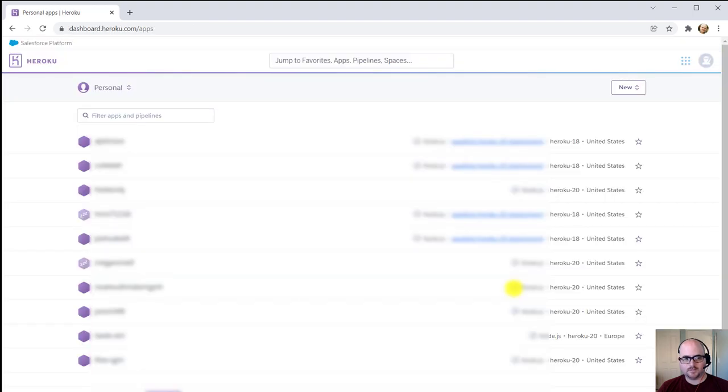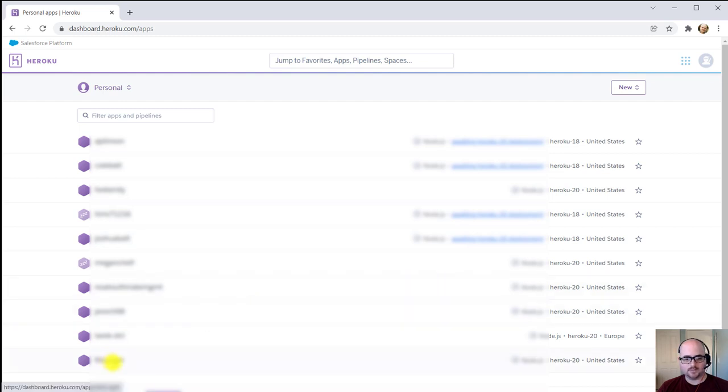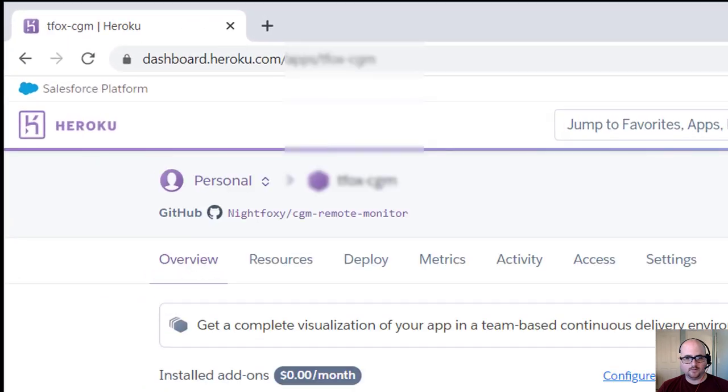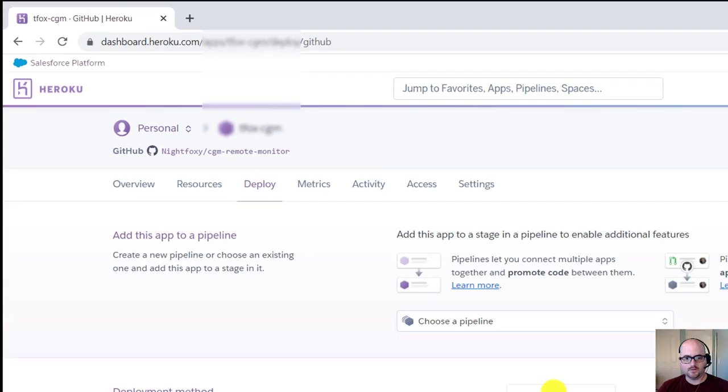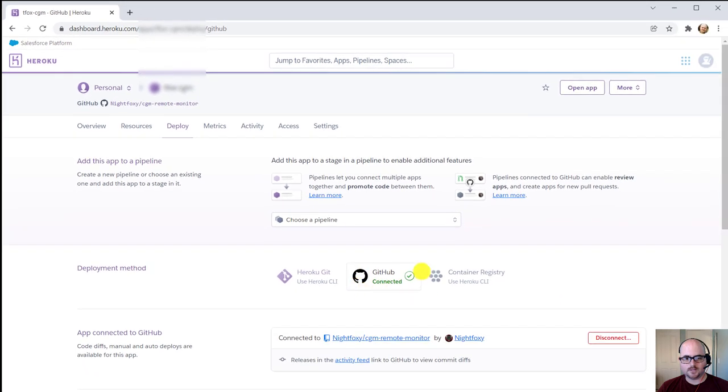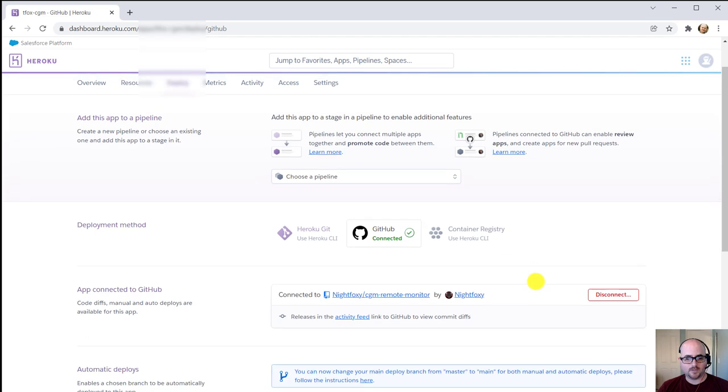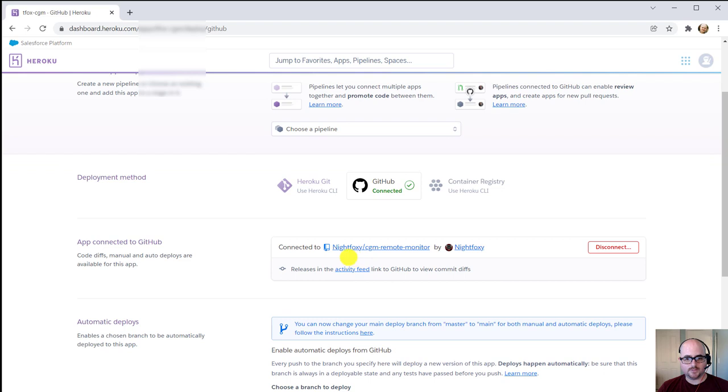From here you'll see your list of sites. Find one you want to update and click on the name of the site. From here you'll go to the Deploy tab here in the center. You should see that GitHub is successfully connected to your Heroku account. If it's not, you can follow the instructions on the update site to fix that. When you scroll down, you'll see your repository for CGM Remote Monitor connected already.